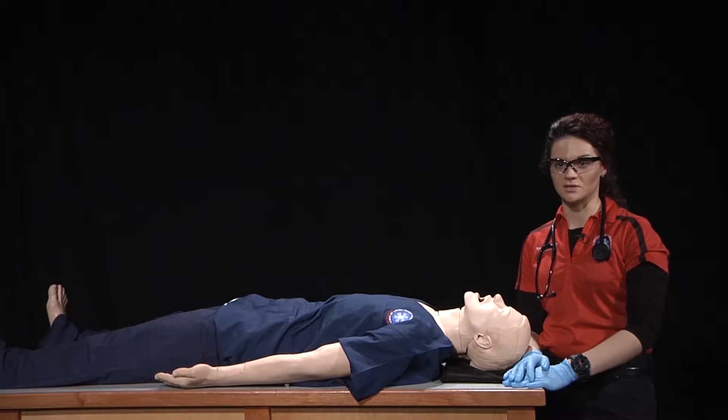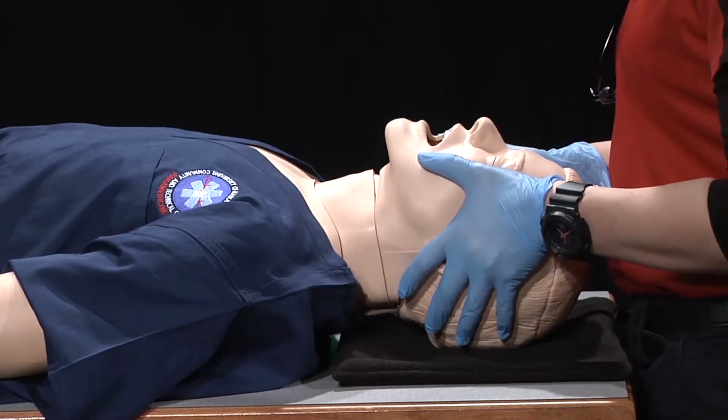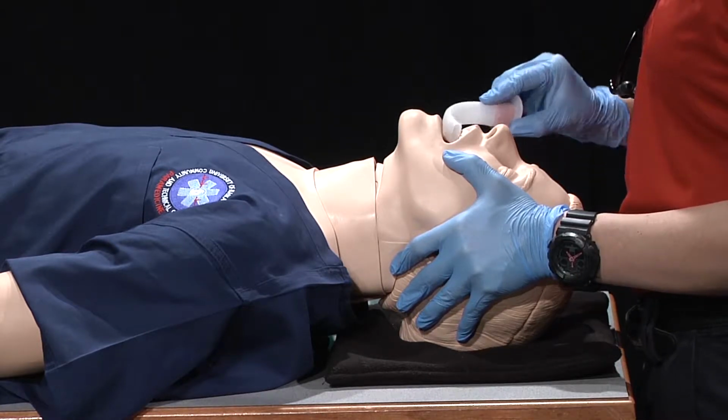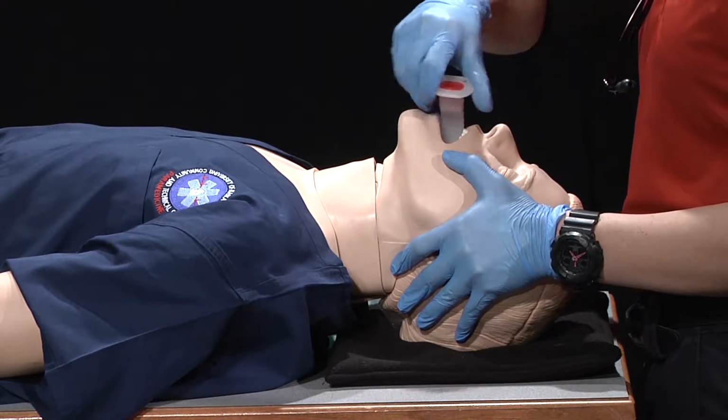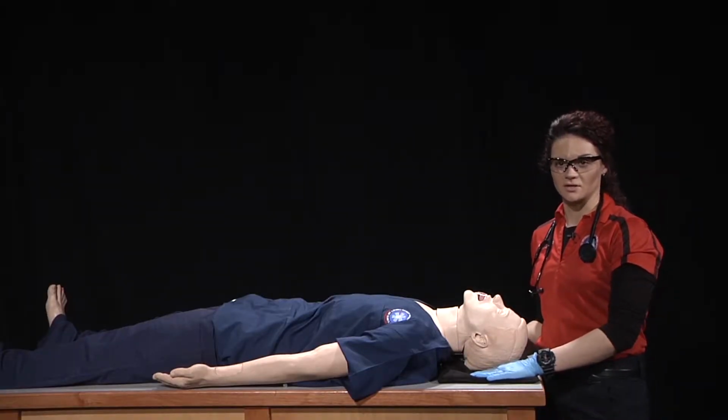The first thing we want to do is manually open the patient's airway and insert an oropharyngeal airway. After inserting the adjunct, we want to provide ventilations to our patient with our BVM at a rate of 10 to 12 breaths per minute with sufficient volume enough to see chest rise.